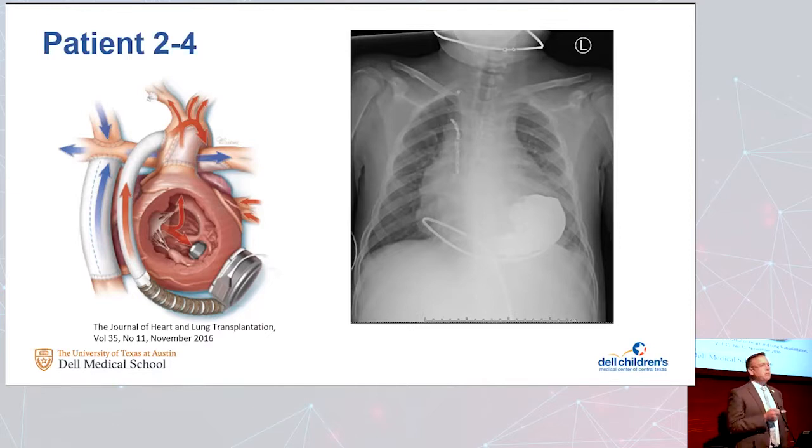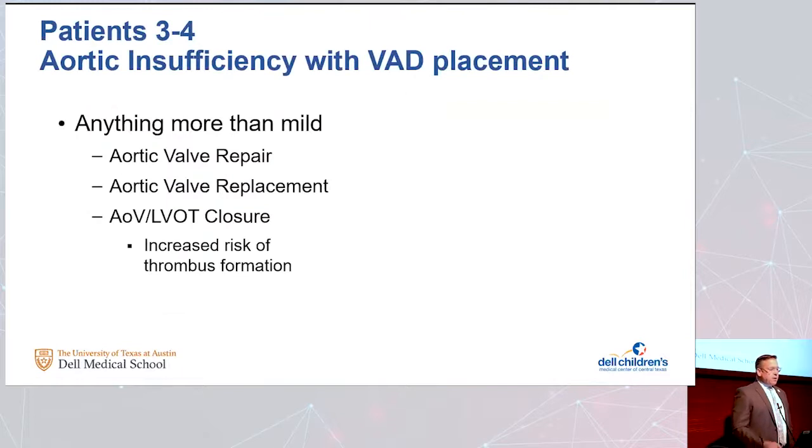So the second problem you see in these patients is where you're going to put the aortic anastomosis. This whole ascending aorta has been mutilated. It's full of suture lines, unusual connections of the pulmonary artery and the original aorta, making a neo-aorta, and foreign materials, whether that be cadaveric tissues or Dacron or whatever. So you have to find a place to fit this graft. So that's a challenge as well. Also challenges you see with these patients.